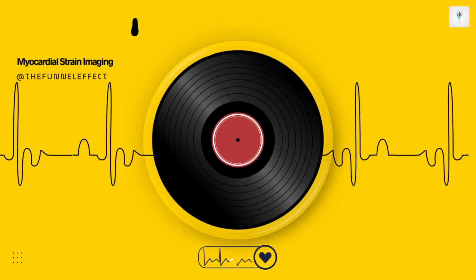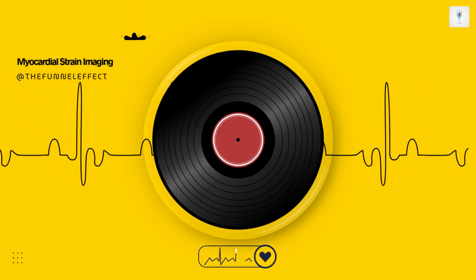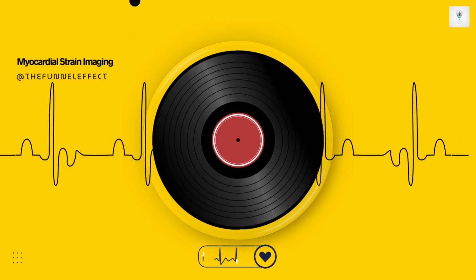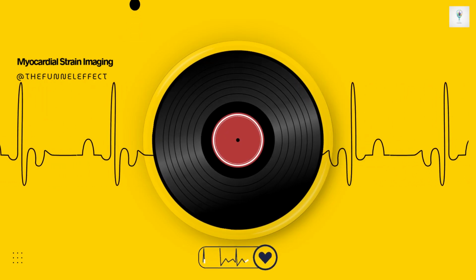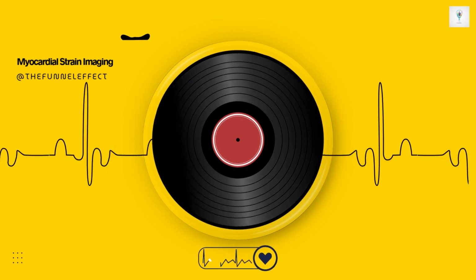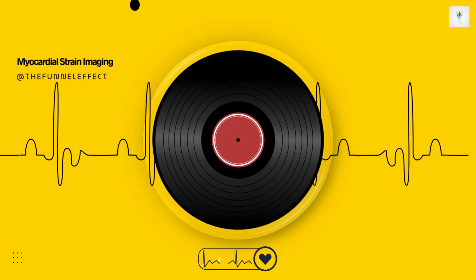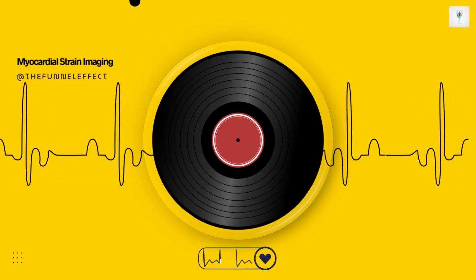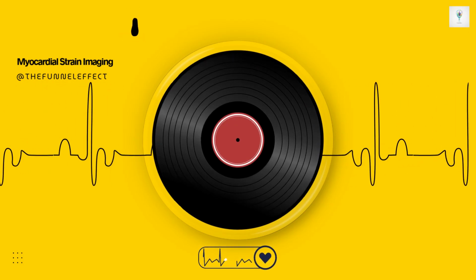Which means if a patient has a big drop in longitudinal function, let's say their GLS goes from a healthy -20% down to -12%, which is quite significant, because that long axis shortening only accounts for a third of the volume change, the LVEF calculation might barely budge. It could easily stay within the normal range. Precisely. LVEF is inherently insensitive to isolated or early changes in longitudinal function. A clinically important reduction in GLS might only cause a tiny, often still technically normal, dip in EF. This explains why the relationship graphically between GLS and EF is much flatter than the relationship between global circumferential strain and EF. That makes perfect sense.